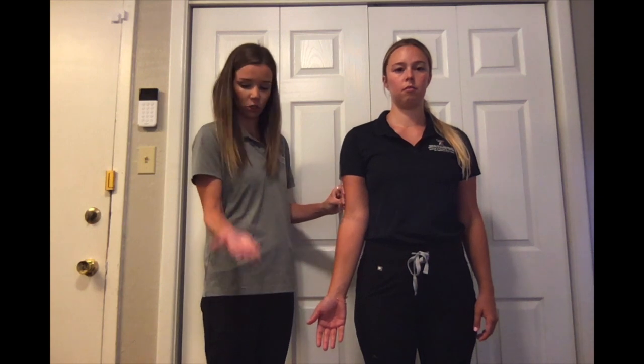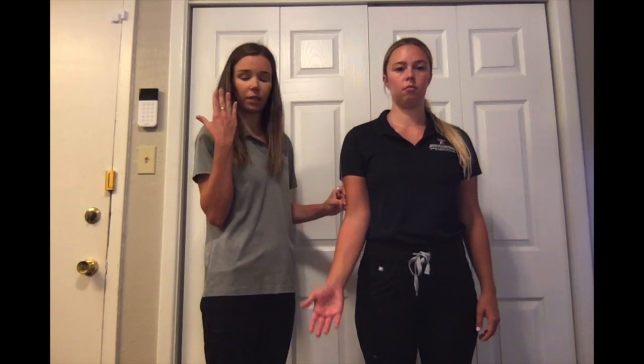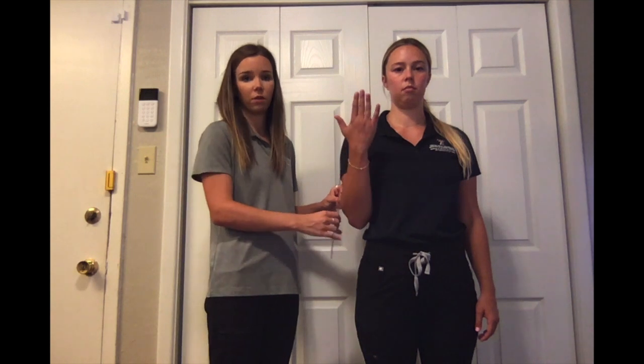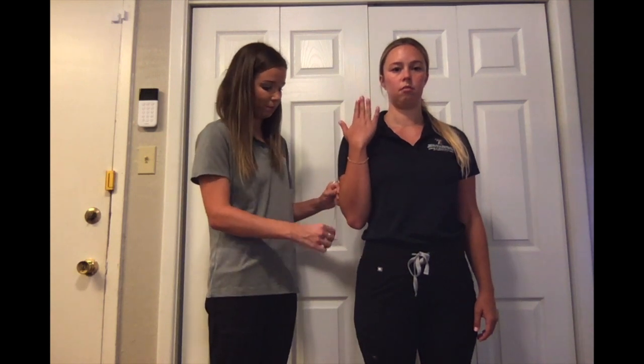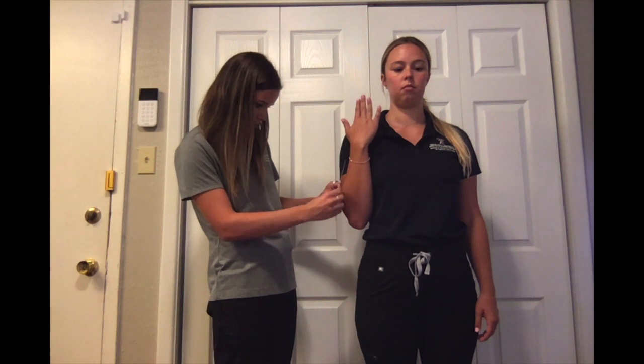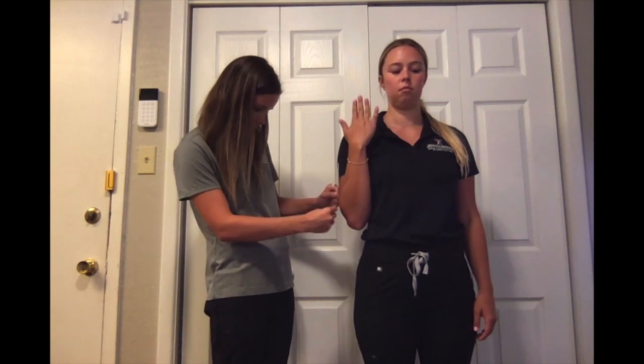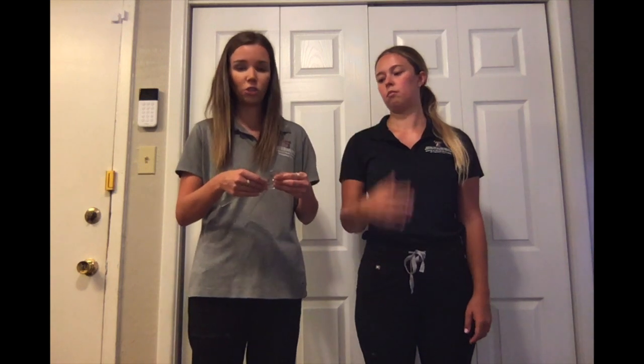Addison, I want you to bring your hand up to your shoulder, and the client's forearm is going to remain supinated. Addison has 145 degrees of elbow flexion. The norm for elbow flexion is 135 to 150 degrees.